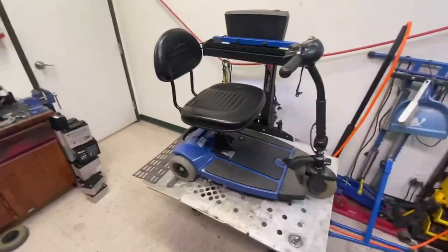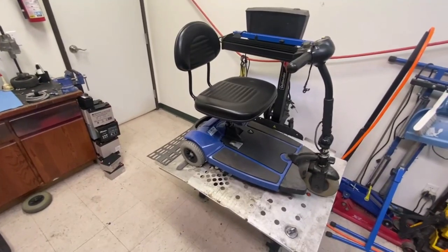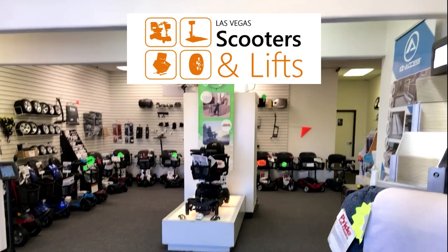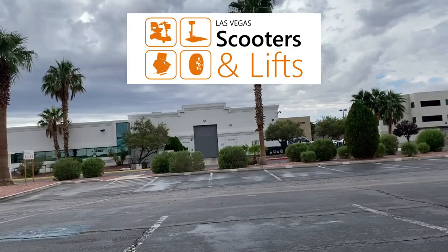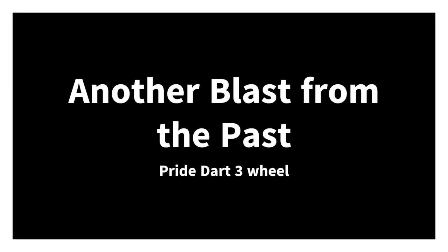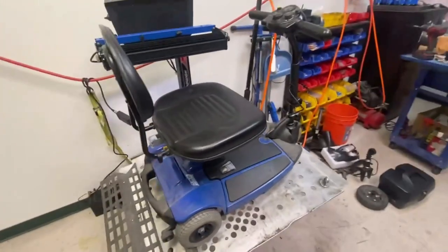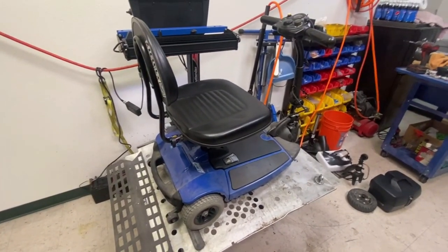Hey, it's Ian from Las Vegas Scooters and Lifts again. Today I've got a little project diagnosis to do on a Pride Dart. Here she is in all her glory — an early bird 2003 Pride Dart.